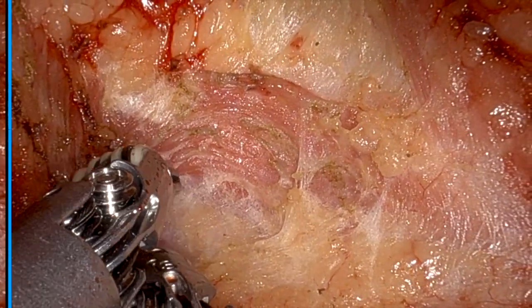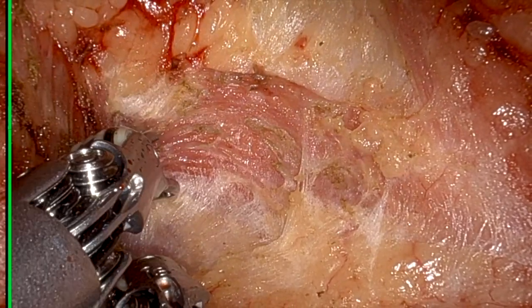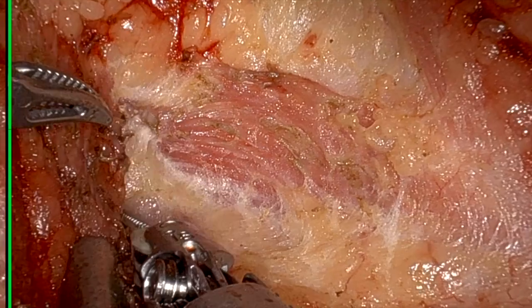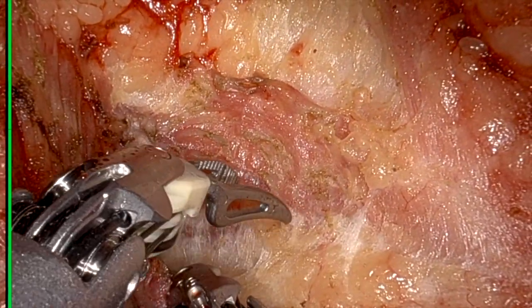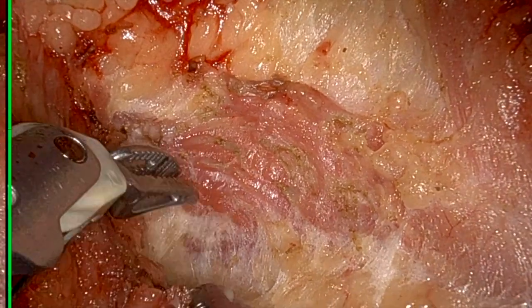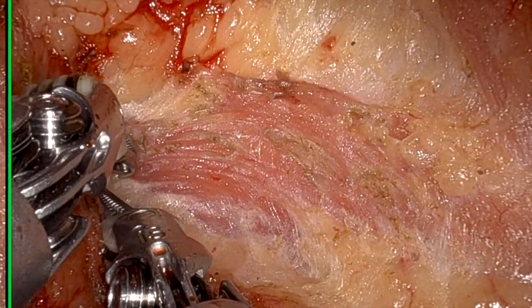First I raise subplatysmal flap under headlight, then I put the retractor in, then I do little bit more raising under robotic camera to get better exposure. Can you appreciate more platysmal fibers? Can you appreciate the quality of vision with robotic camera? So isn't it absolutely fantastic to raise the flap under robotic camera? Now, I am moving upwards.